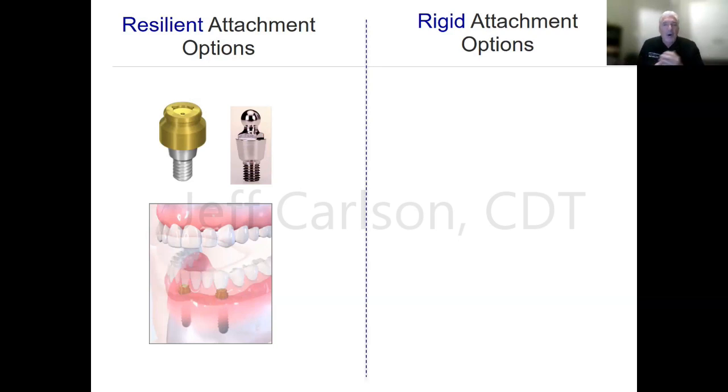As hopefully you all are aware, with implant dentistry, one of the key things for long-term success beyond patients' home care, which is their responsibility, is how you design these cases to distribute the loads generated during function over as great an area as possible and as quickly as possible. To the degree that you're able to do that, that's where you see the long-term success on these restorations.